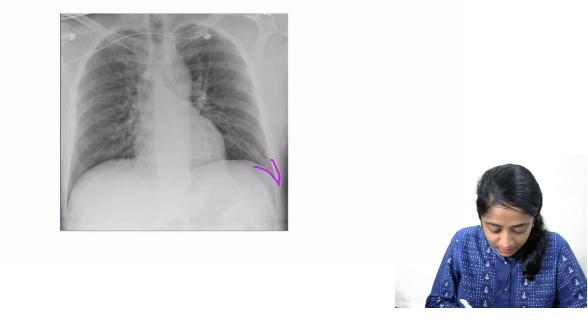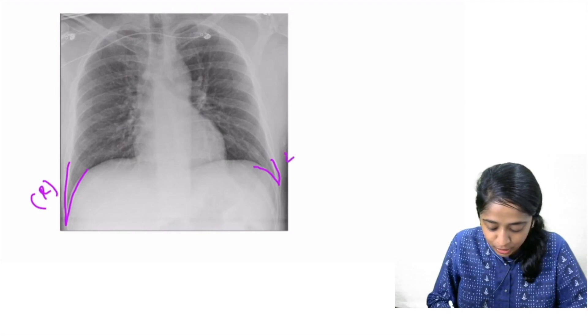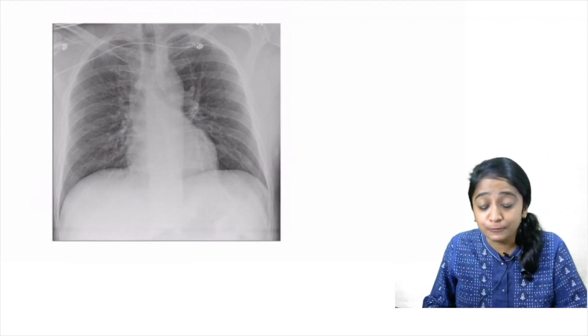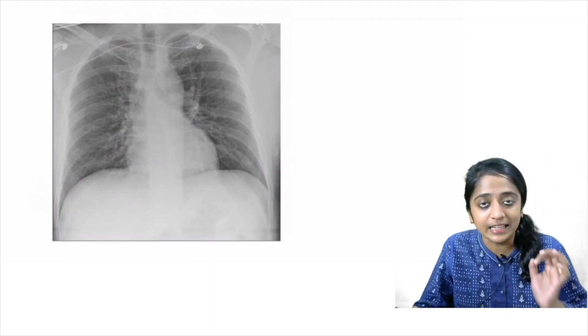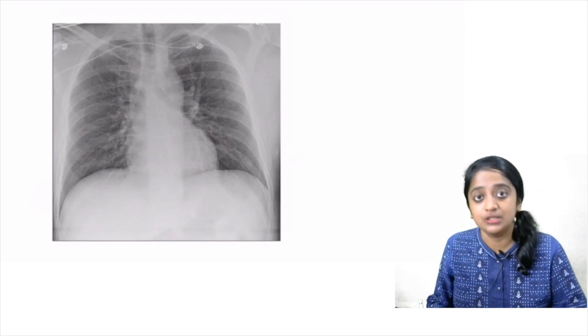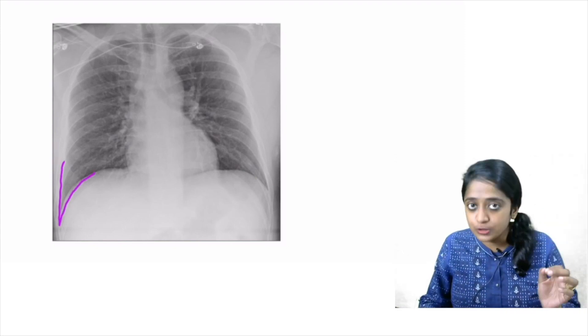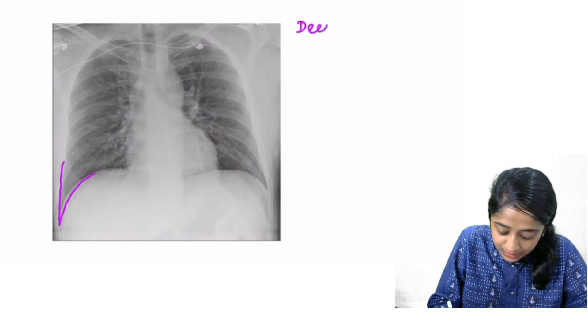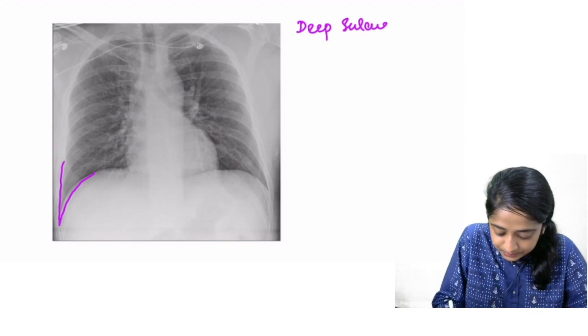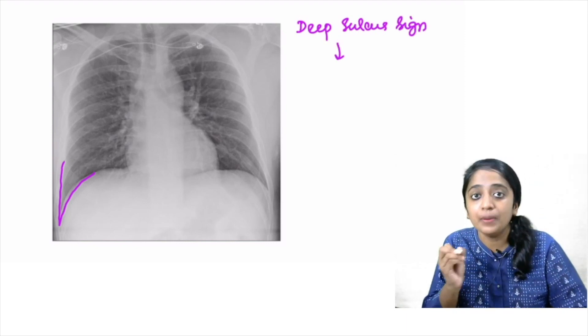I feel that the right costophrenic angle is much more deeper as compared to the left. So is this finding relevant? Does it indicate towards any particular pathology? The answer is yes. Now a question comes, where do you get deep sulcus sign?